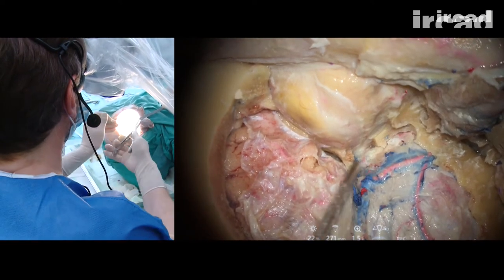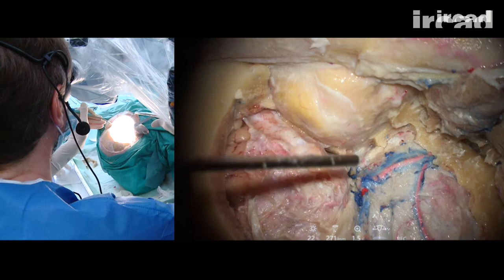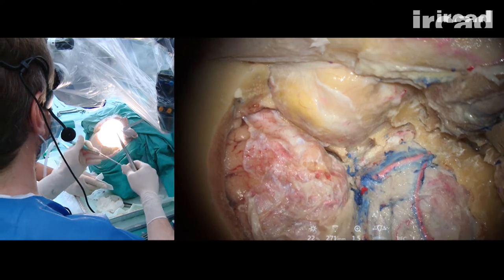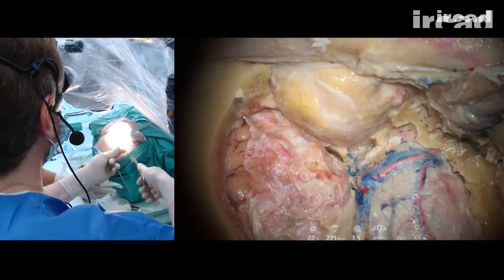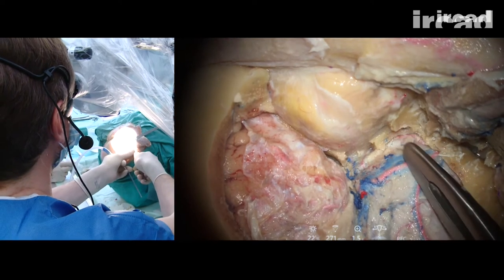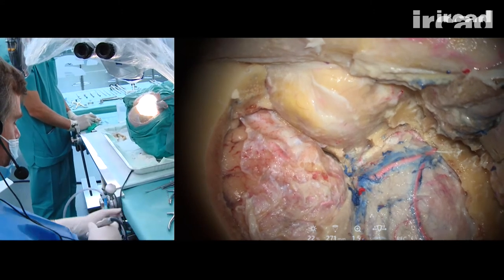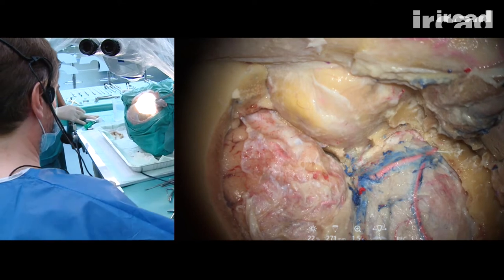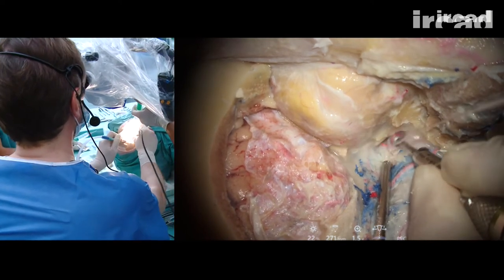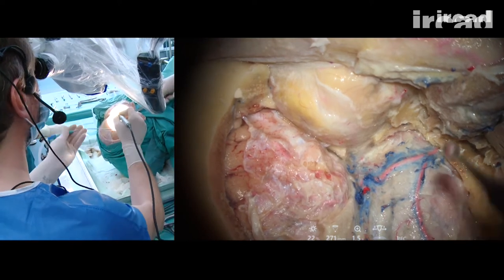Okay, so we have opened the superior orbital fissure completely. Okay. And now we can start to elevate the dura from the most anterior aspect of the cavernous sinus, cutting the orbitotemporal periosteal fold in order to increase the exposure of the clinoid process.